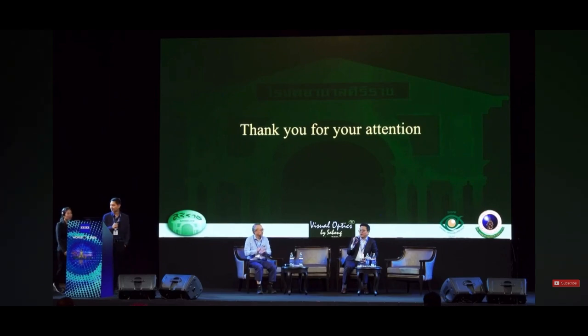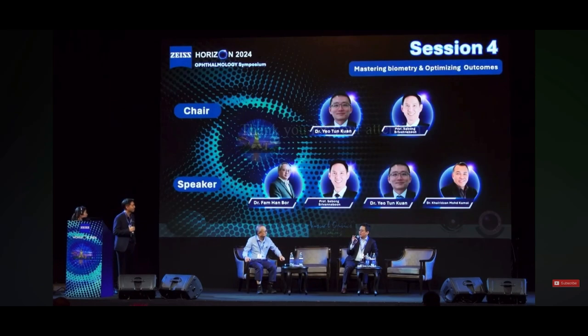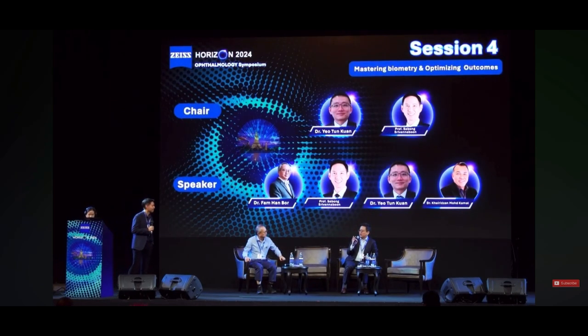Thank you, Dr. Sabong. I think that was excellent. If you want to take any key takeaway, it is really looking at standard K and TK values in determining whether this patient had a hyperopic LASIK or myopic LASIK. Really, really helpful in my practice. Thanks, Dr. Sabong. Yes, thank you.